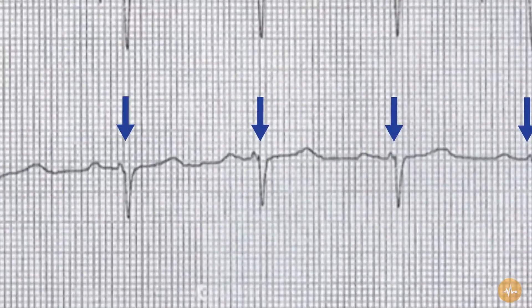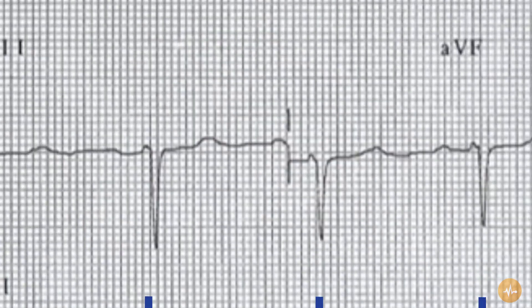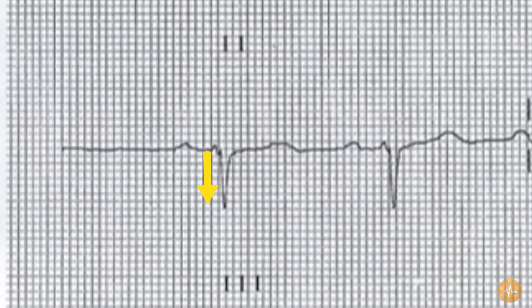The PR interval is borderline prolonged at 210 ms, or just over 5 small squares. The QRS duration is normal at less than 3 small squares.